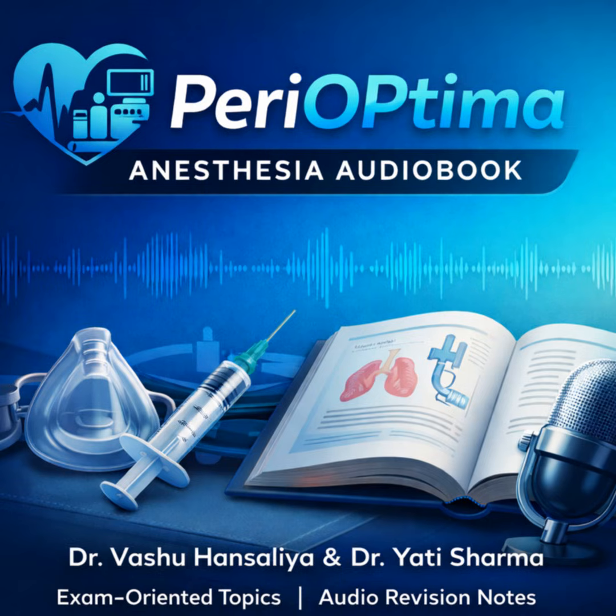And the practical show-me questions. They'll ask you to describe the mechanical difference between the Macintosh and Miller: vallecula versus direct lift. And that big comparison of DL versus VL in a difficult airway will definitely come up. And be ready to instantly describe the features of a McCoy blade. What are the common student mistakes that will cost them marks?